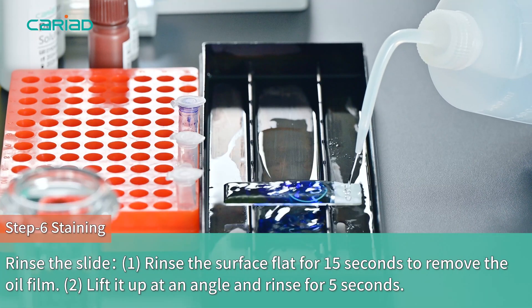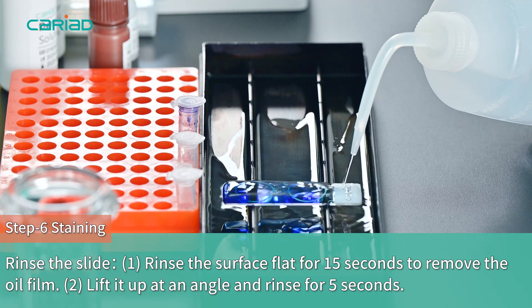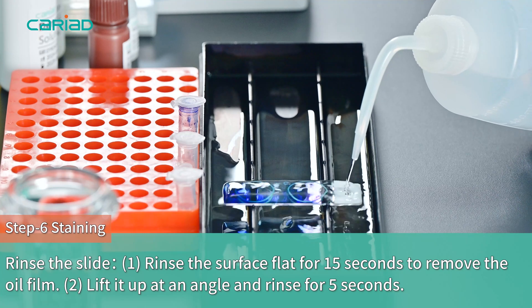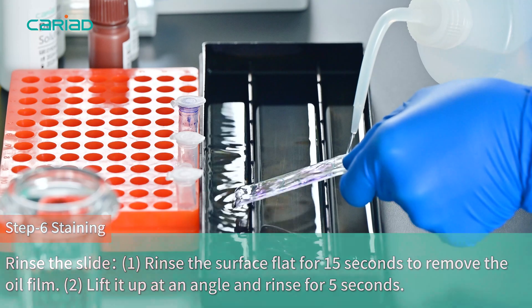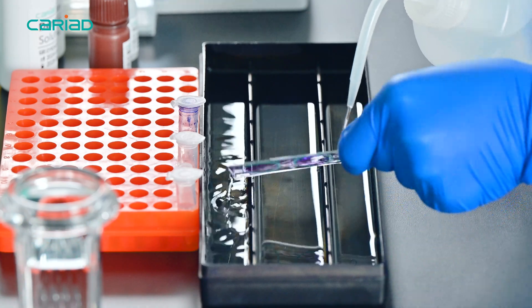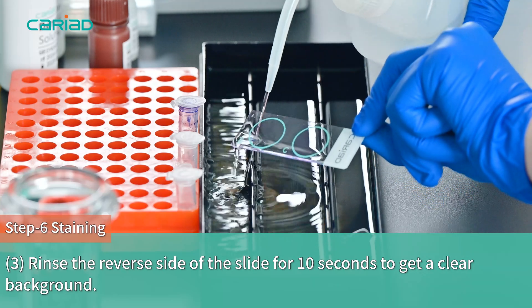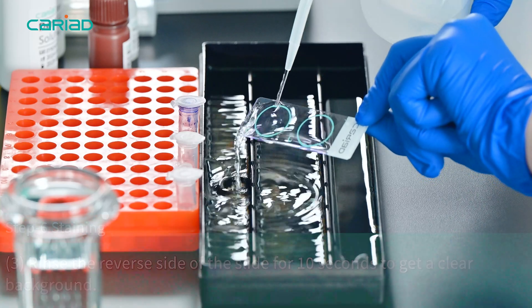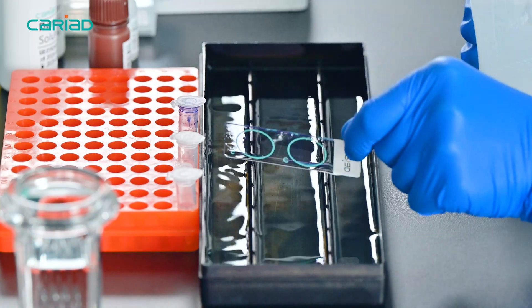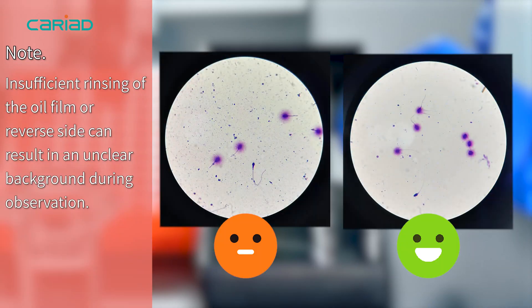Rinse the slide: first rinse the surface for 15 seconds to remove the oil film. Second, lift it up at an angle and rinse for 5 seconds. Last, rinse the reverse side of the slide for 10 seconds to get a clear background. Note: insufficient rinsing of the oil film or reverse side can result in an unclear background during observation.